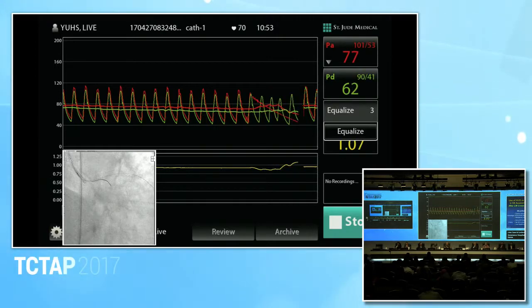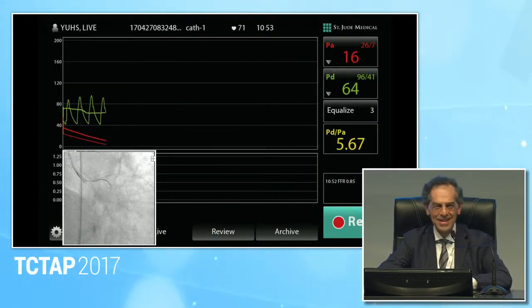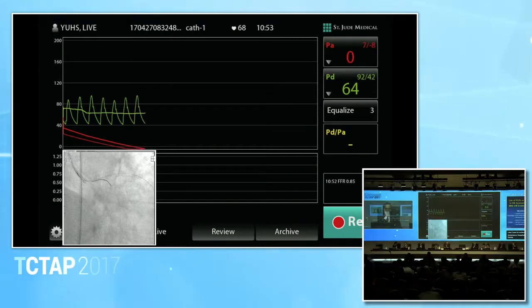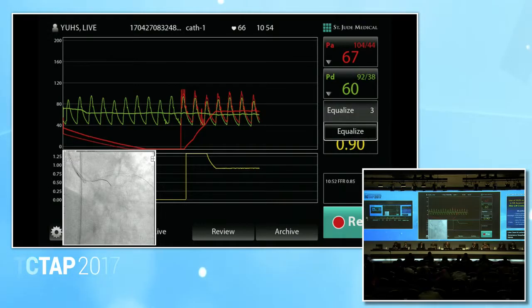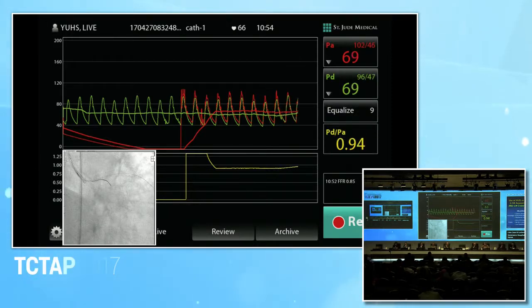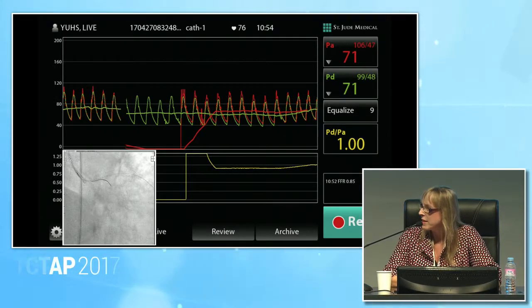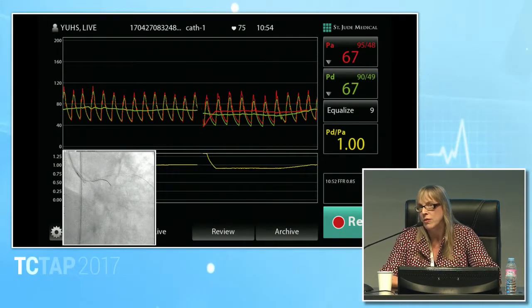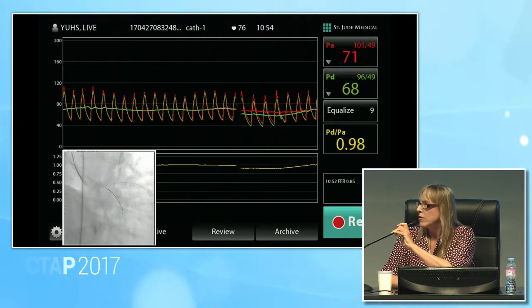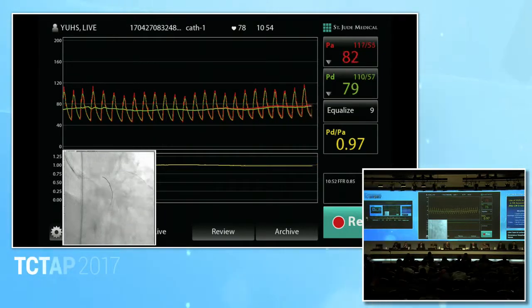So the final message is it's much easier to run one IVUS pullback than doing an FFR assessment. Completely agree with you, Julia. Good comment. No, it's not always this way. Yeah, but I think you have a point. Doing a correct FFR measurement or any hemodynamic measurement is sometimes more demanding than just implanting a stent. That's right. I think this is an important point for training and also for how we teach our fellows. Pay attention to the detail, equalization again and so on, and be patient.